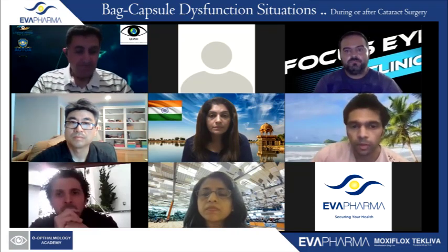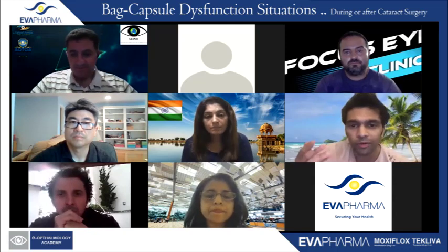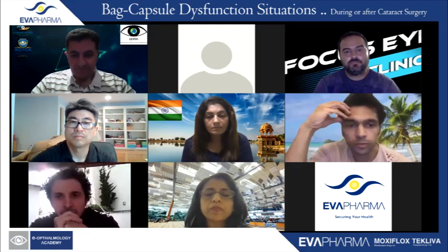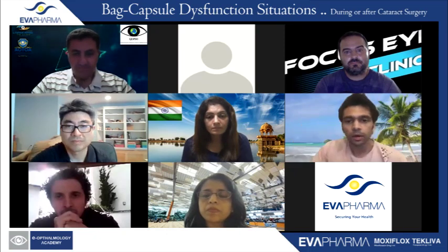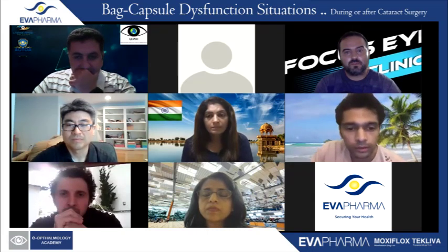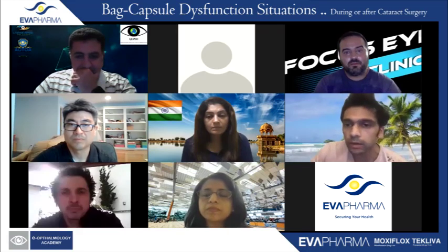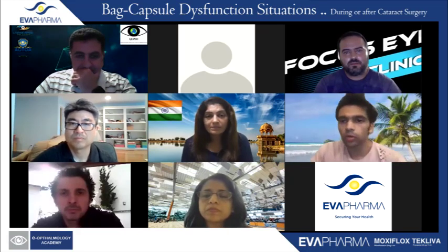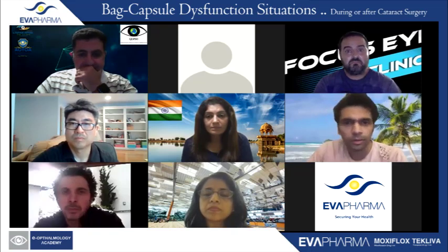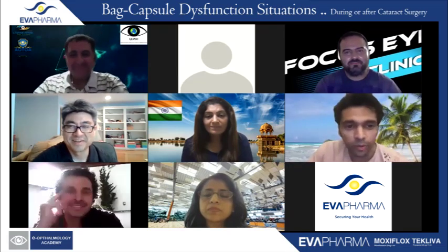I would like to comment, when fixing a single piece IOL to the iris, the formation of UGH syndrome is possible. I met it in practice. It's a comment. Could we use methylcellulose only? I'm not sure if this is meant for your presentation though. Okay. Just going to move on then.